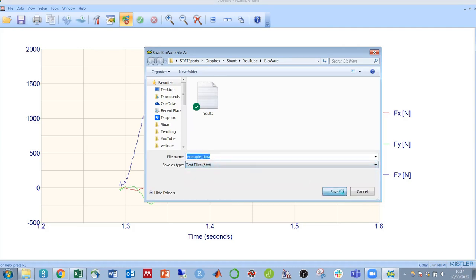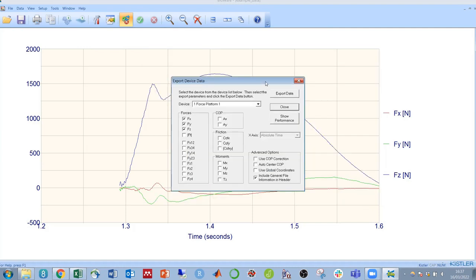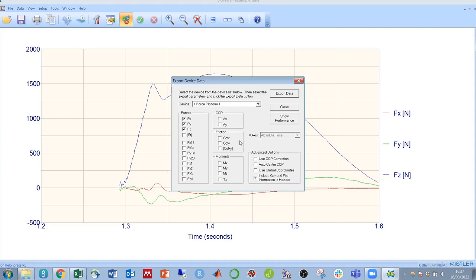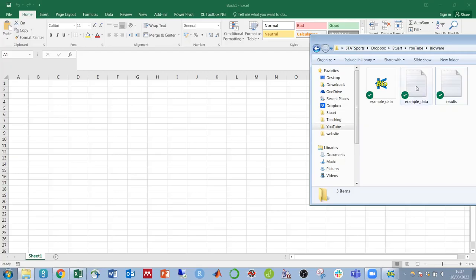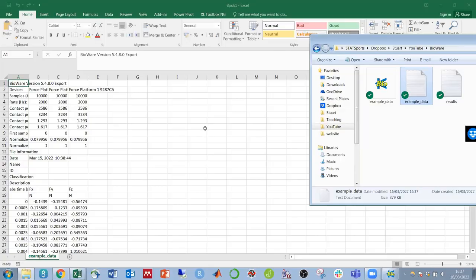So we'll call this example data. A box will then pop up and you can select the axes that you wish to export, the force platforms if there's more than one. You can also decide whether or not to save center of pressure data or any other data. After exporting that, that can again be opened in Excel.